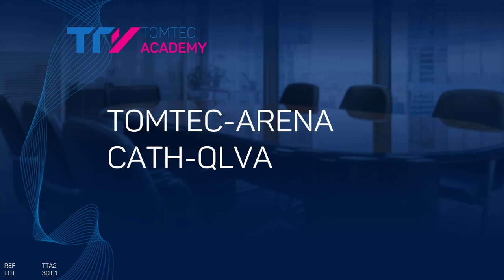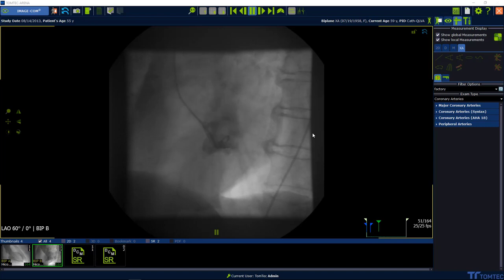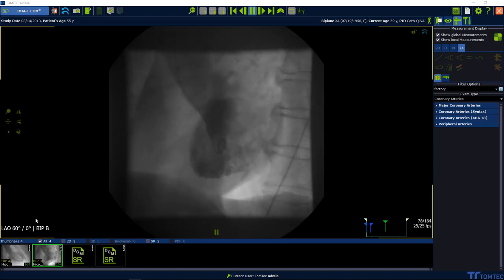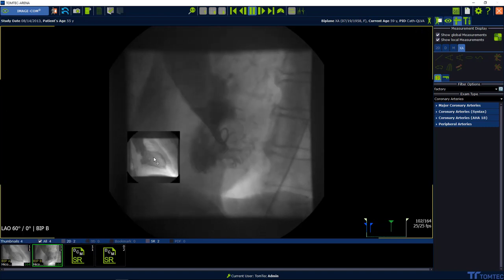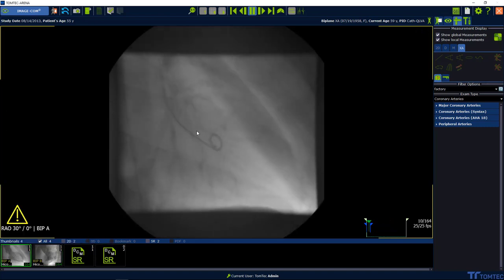How to use CATH-QLVA. Start from ImageCom. Drag and drop an image into the workspace.